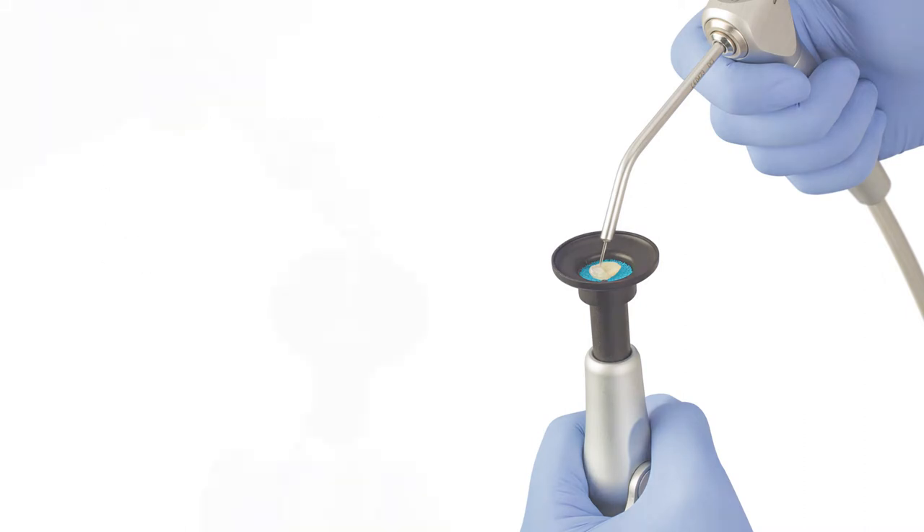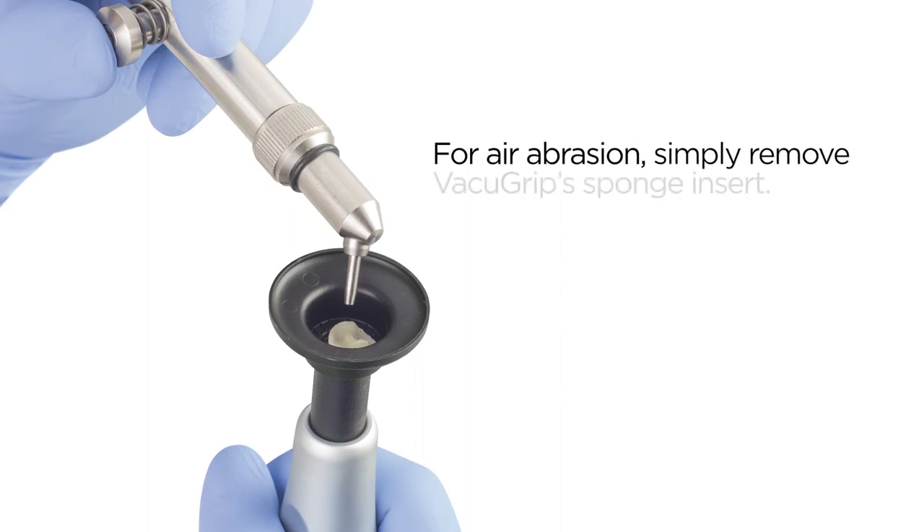For procedures requiring air abrasion, simply remove the VacuGrip sponge insert. This helps reduce overspray and allows for the evacuation of spent aluminum oxide particles through the screen base.